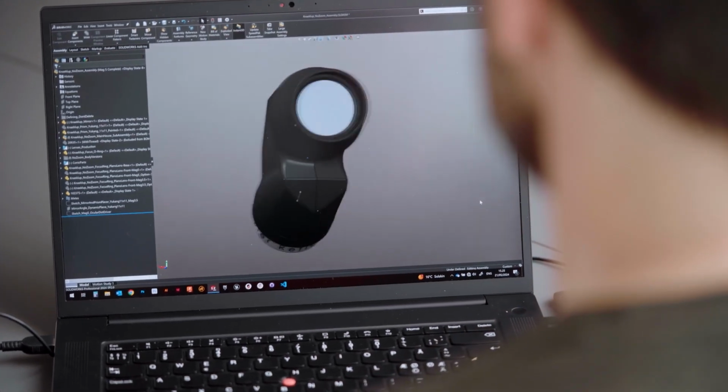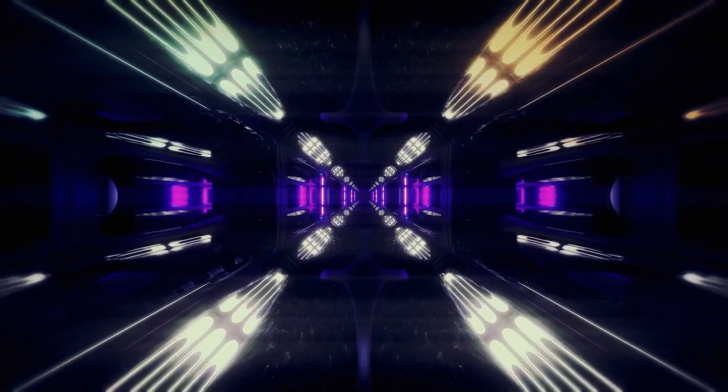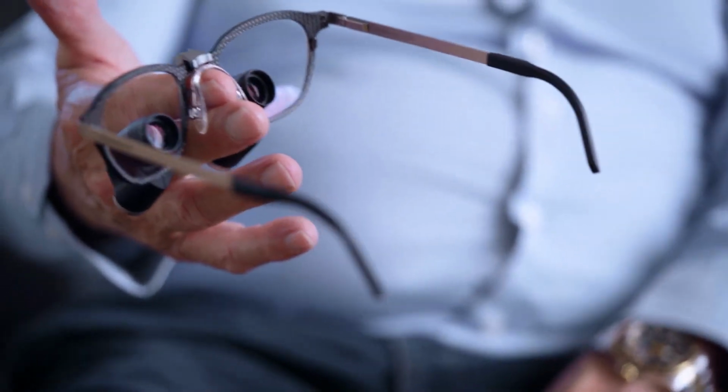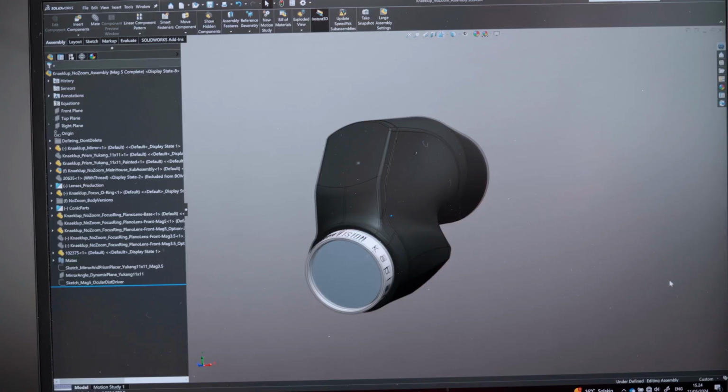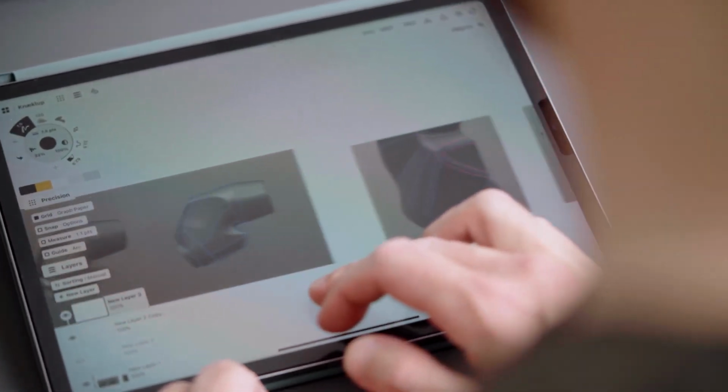All these kinds of organic structures are generally my primary inspiration. There's a lot of, even a sports car, a spaceship, all sorts of smoothly flowing organic surfaces in there when you look at the details. It was quite a big challenge reaching this design because of the physical limitations of how thin these shell pieces can be. We had already chosen magnesium as a material, especially because it is very light. I had to go back and forth with the manufacturing people. The initial response to what I wanted was that this is not possible to make.